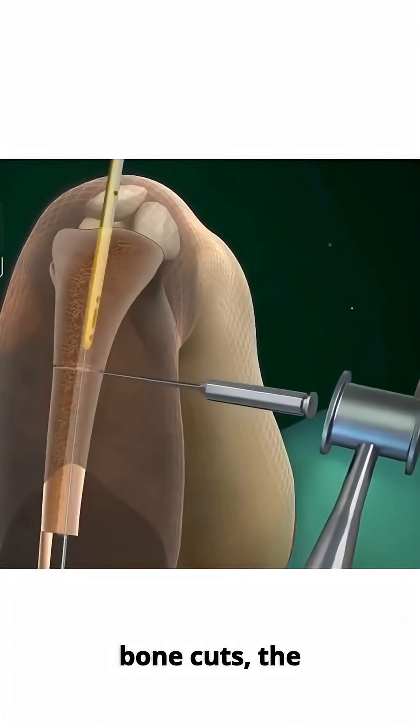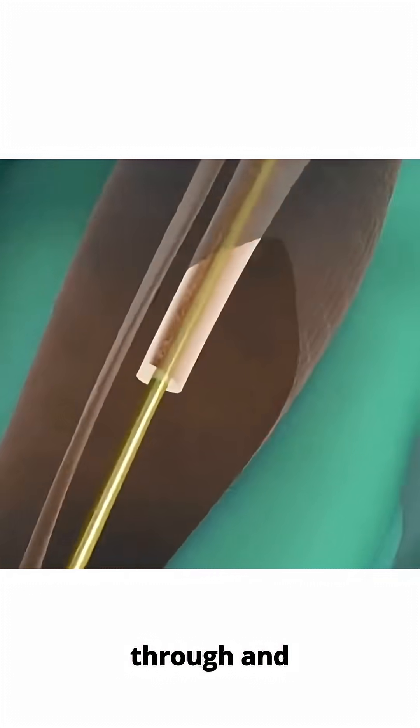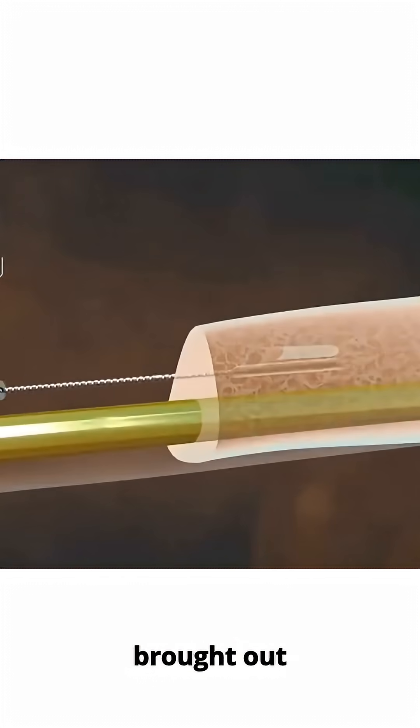After completing the bone cuts, the nail is locked into place with bolts. Small holes are drilled in the bone for cables to pass through and guide the movement. The cables are carefully threaded and brought out through the skin.